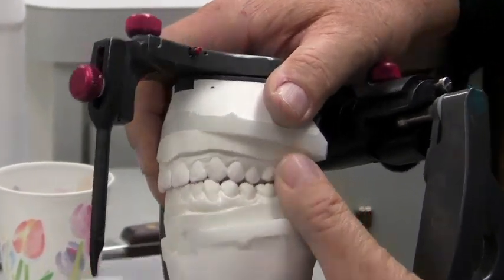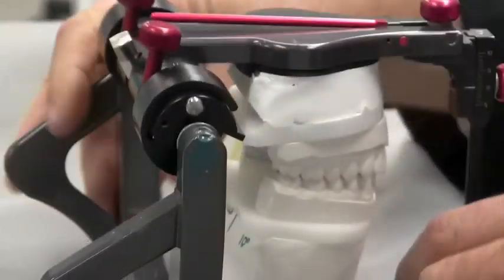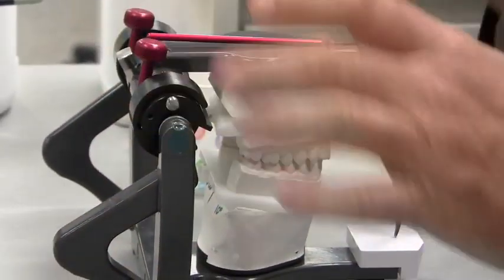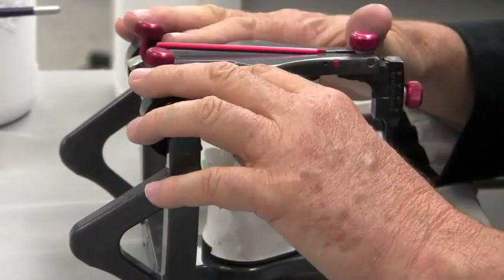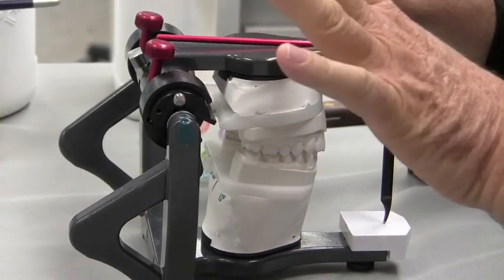If I see these separating like this, then I know I've got a heavy balancing interference and to correct that I need to increase condylar guidance until it's gone. That's why I like adjustable condylar guidance on an articulator. So once we've verified that we indeed have no balancing interferences at 25 degrees, we're good there.